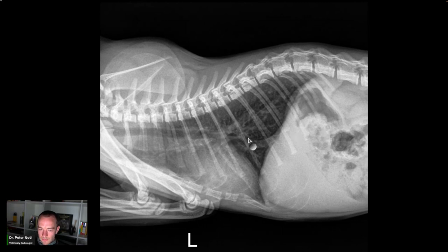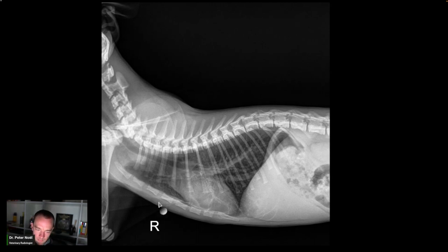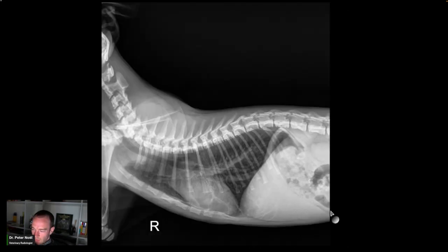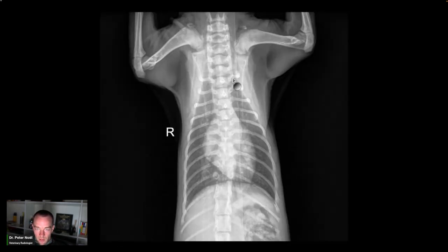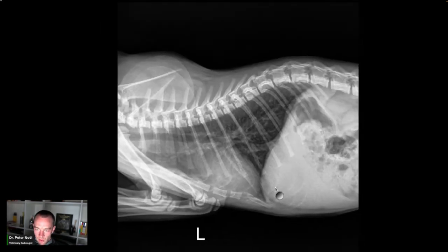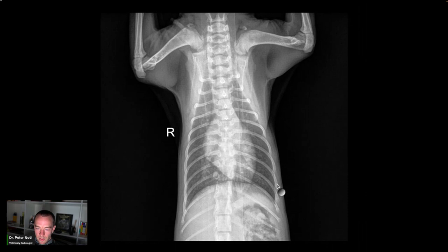The cardiac silhouette is normal in size for the patient's young age. The trachea is normal in luminal diameter and course. The cranial mediastinum is within normal limits. The pleural space is normal. The size of the liver is normal for the patient's young age. Numerous open physes are consistent with the patient's younger age. The lungs are well inflated, and despite the well-inflated lungs, there is a mild diffuse bronchial to bronchointerstitial pattern. Thoracic lymphadenopathy is absent.